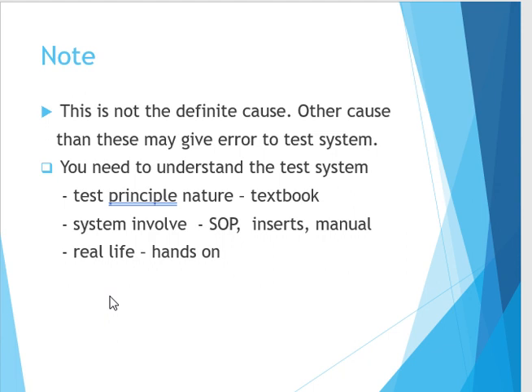So you need to understand the test system. You need to understand the test principle and nature. So you need to read the textbook. You need to understand the system involved. So you need to read and understand the SOP, insert and manual given by the company. And in real life, of course, you need to get hands-on. Whenever there is a problem, you need to get hands-on to troubleshoot the QC problem.